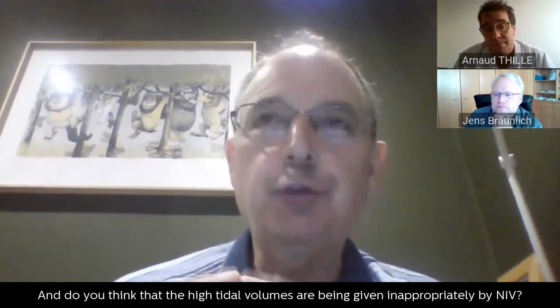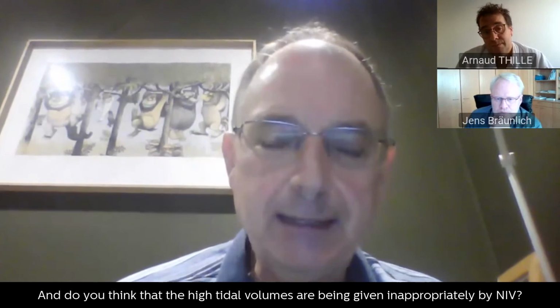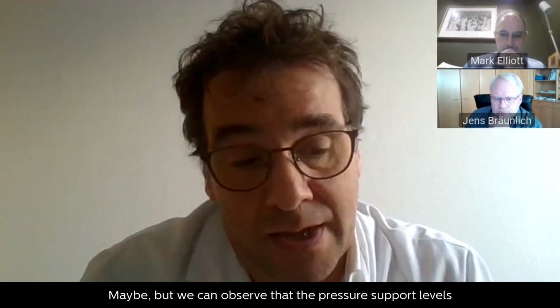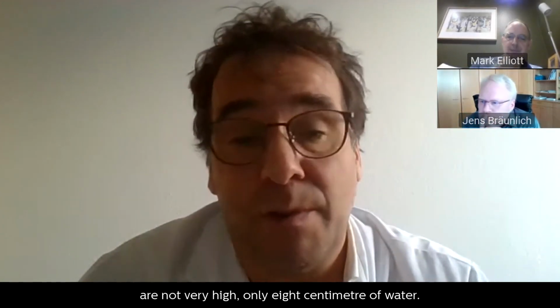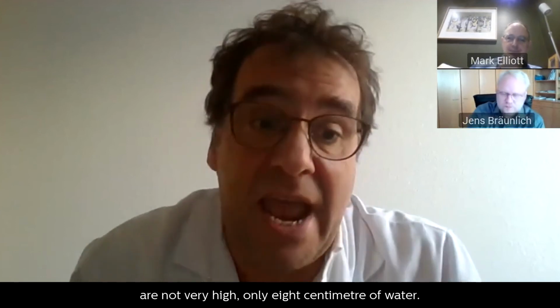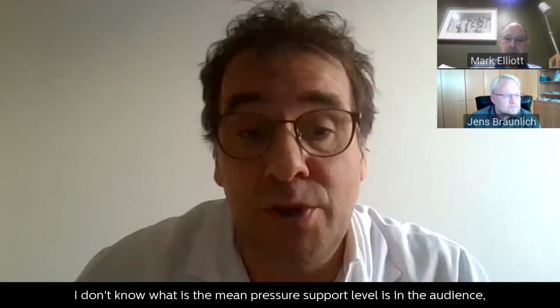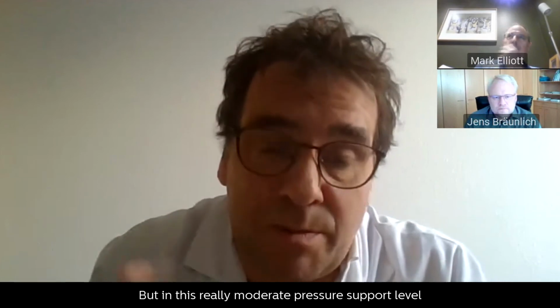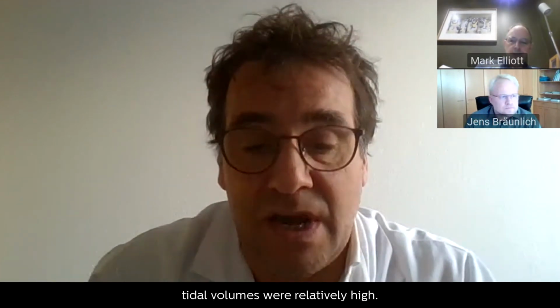And do you think that the high tidal volumes are being given inappropriately by NIV? Maybe, but we can observe that pressure support levels are not very high, only 8 centimeters of water. I don't know what is the mean pressure support level used in the audience, but it's not a really high pressure support level. But despite this relatively moderate pressure support level, tidal volumes were relatively high.